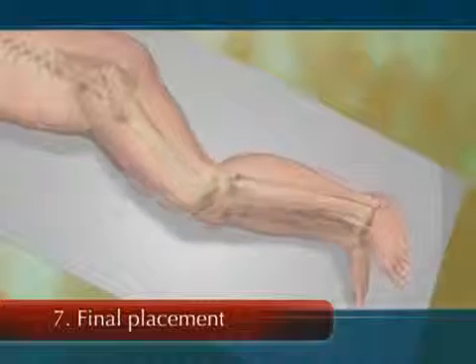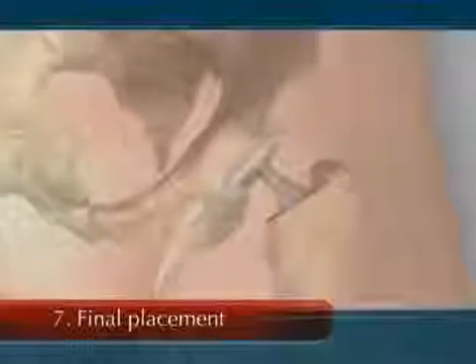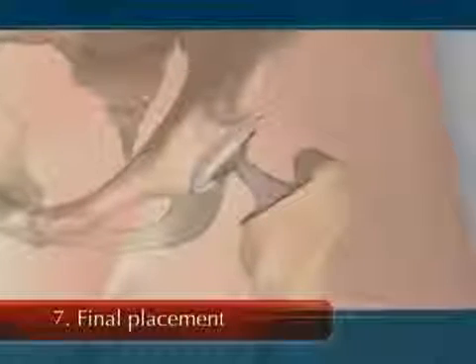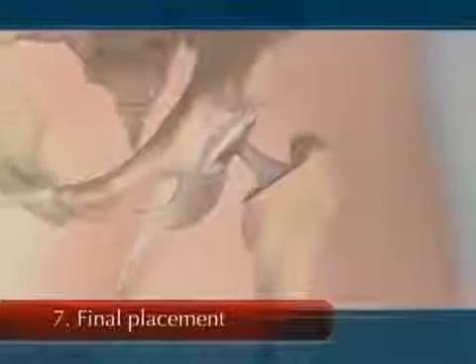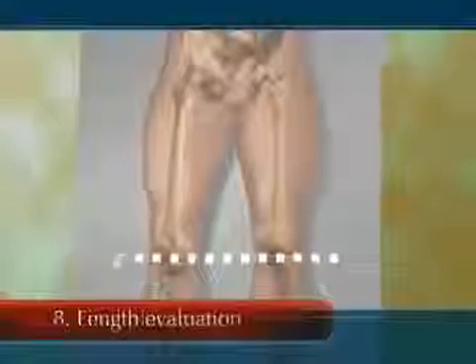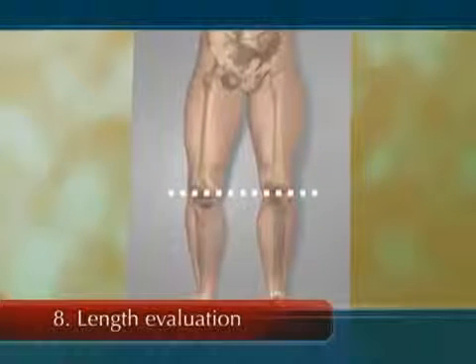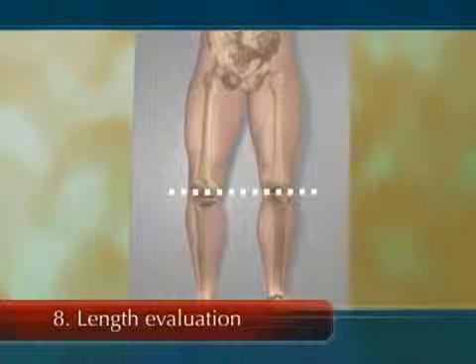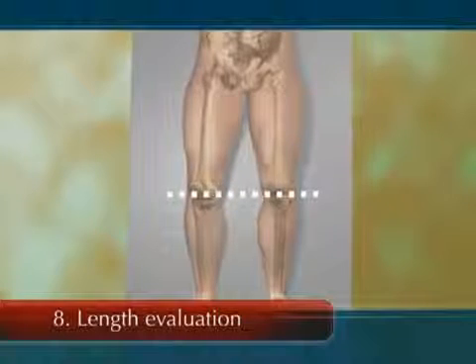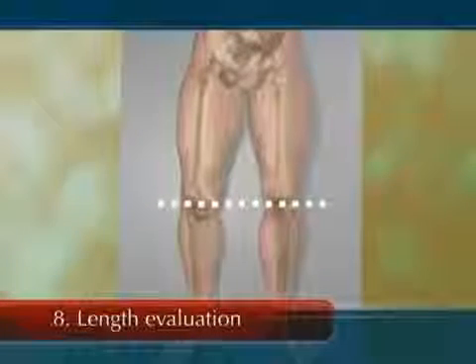Once the appropriate combination has been found, the ball is then placed onto the femoral stem and the final insert is placed into the cup. The leg is evaluated again for stability and mobility and leg length equality. Throughout the operation, numerous measurements and operative considerations are taken to equalize leg lengths. However, the primary goal is to achieve a stable, non-dislocating hip.